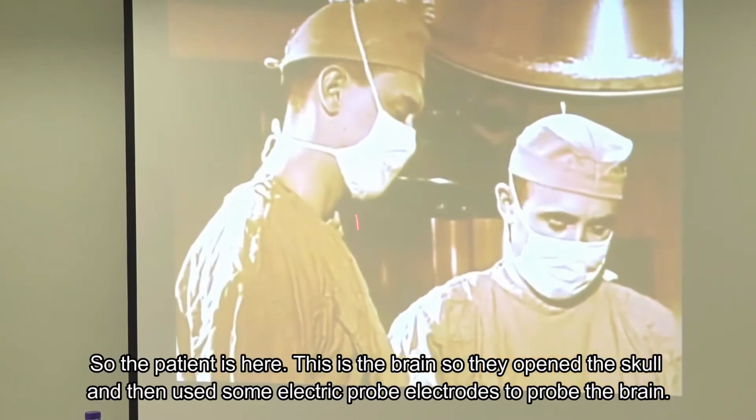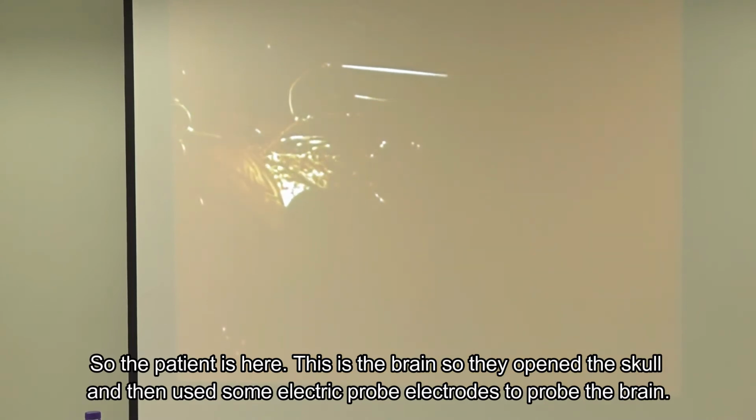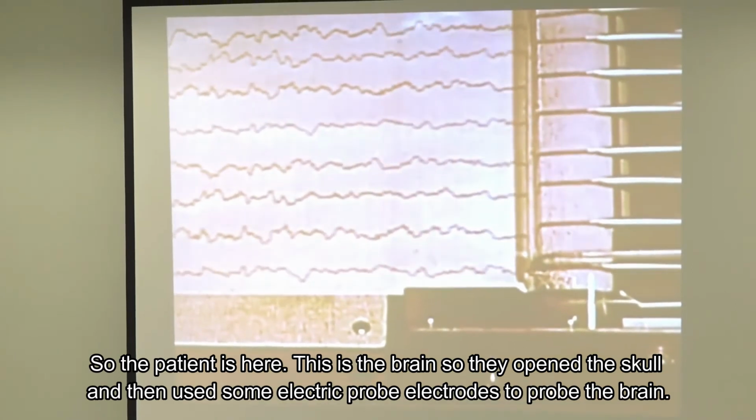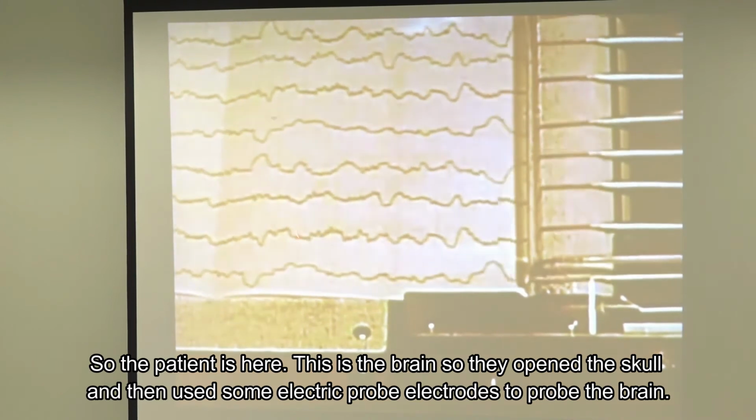So the patient is here. He does not feel anything when the electrode touches the brain. So this is the brain. They open the skull and then use some electric probe electrodes to probe the brain.